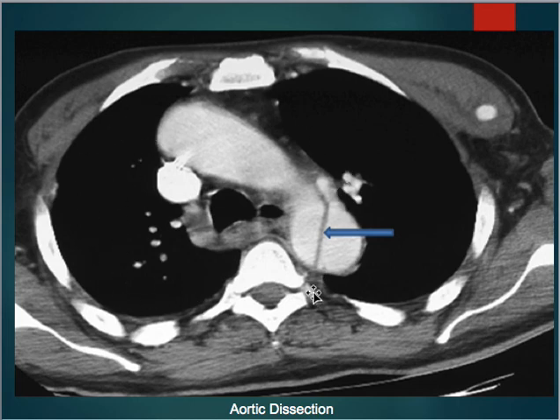This image is actually an aortic dissection. You can see this line here. An aortic dissection is a tear in the large blood vessel that branches off from the heart. Symptoms for that can be sudden severe chest pain, back pain that radiates into the neck, shortness of breath, or loss of consciousness. Main causes for aortic dissection are chronic high blood pressure. Usually this occurs more in patients who are a little bit older, males that are about 60 to 70. Treatment can include surgery or sometimes medication like beta blockers.